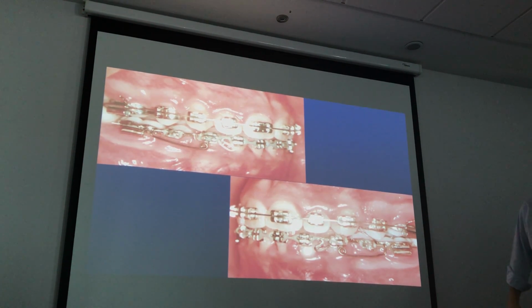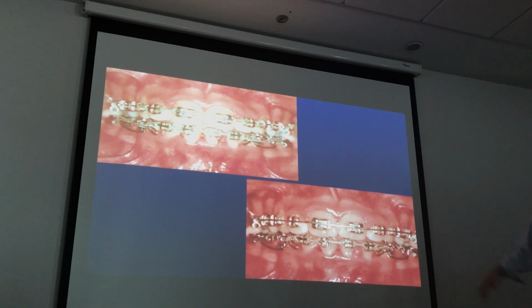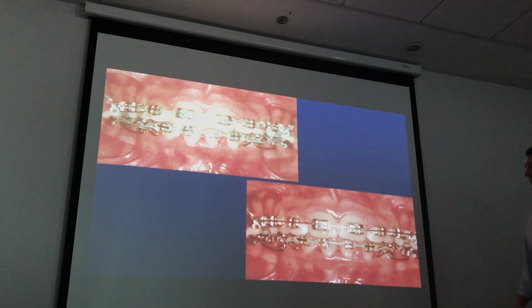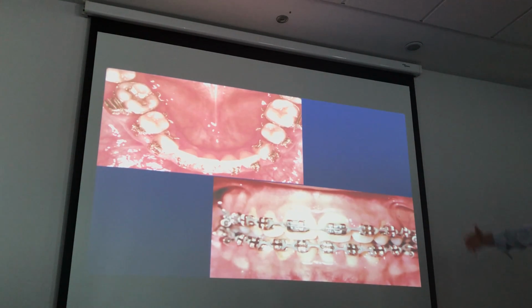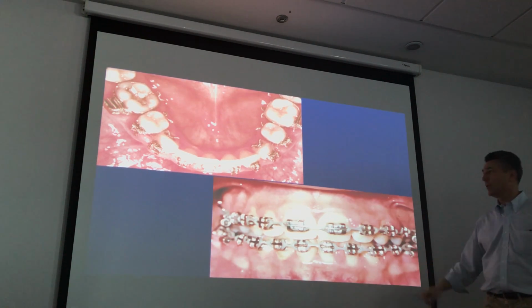Almost done. No change in the overjet. Little by little it is closing. No change on the midline, no change in the overjet.